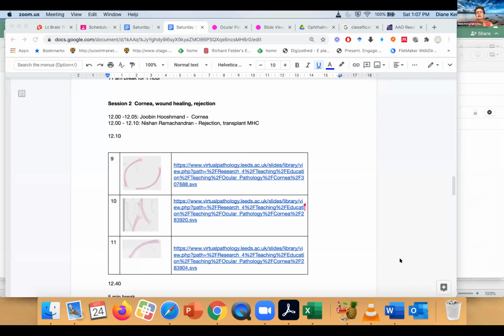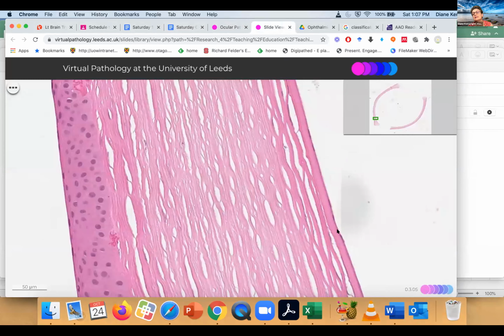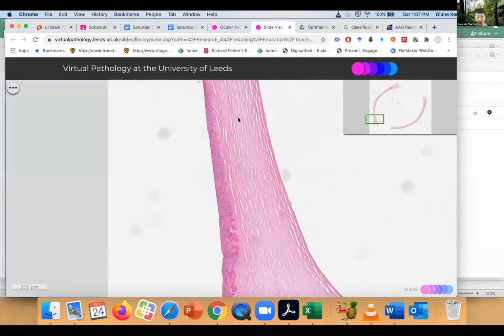Okay. Let's move on to the next one. Oh, sorry, I forgot to share the screen there. I'll just share the screen and show you. I should be given a D for Zoom today. Right, let's go back here. All right, yes, here they are. This is the nuclei of them here. They're not very distinct, but they're present. So that's part of identifying normal before you dive into the abnormal. Okay, let's stop sharing.